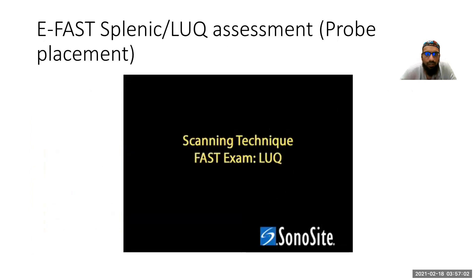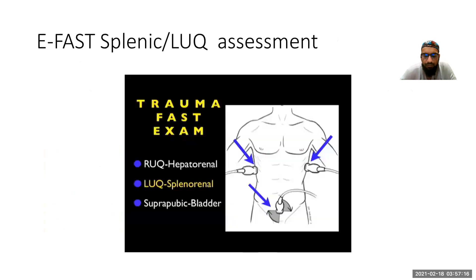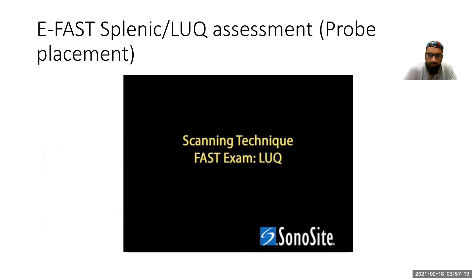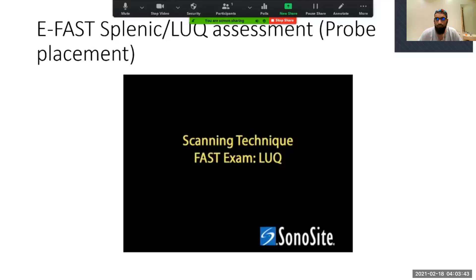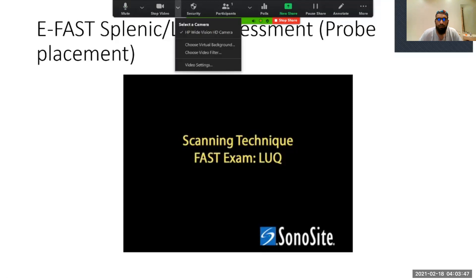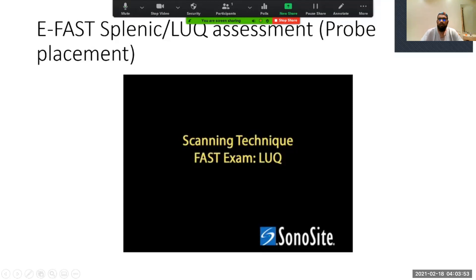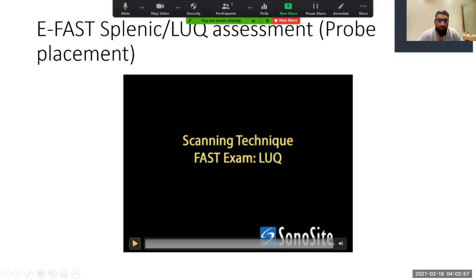So we're going to look at how we scan a patient. Let's try to start the video — okay, sorry about that guys, there was a problem getting the video started, so we're going to jump straight into this. This is how you place the probe.